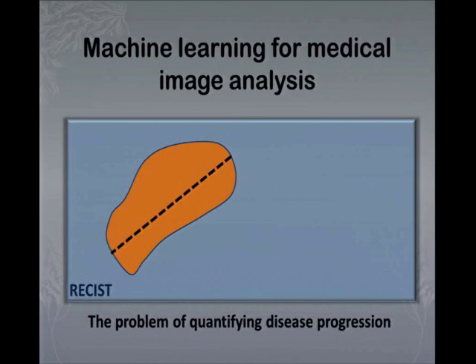So, for instance, in a case of a tumor patient, you look at the patient data, say MR, magnetic resonance, and you say, yeah, that looks like a tumor. It looks like a glioblastoma tumor. It looks like grade 3, but it all just looks like. And then you get a new set of images after a month or a week, and you try to assess whether the tumor is growing or shrinking, whether the radiotherapy or chemotherapy is working or not.